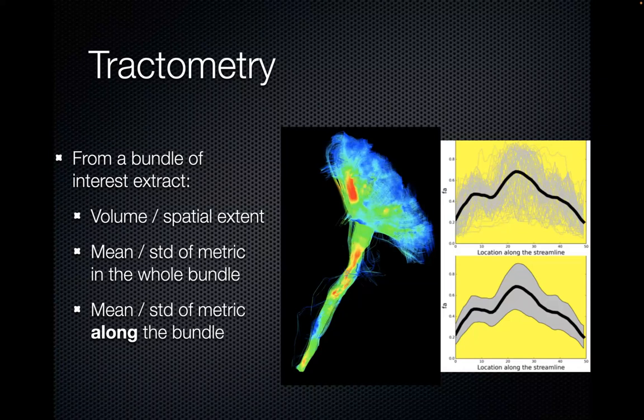But it's hard because it's very high dimensional. We have 50 such tracks. Each track has 10 or more features. So yeah, we need new statistics. We need new computational methods and models to analyze these inputs.